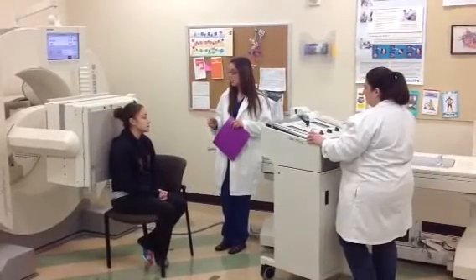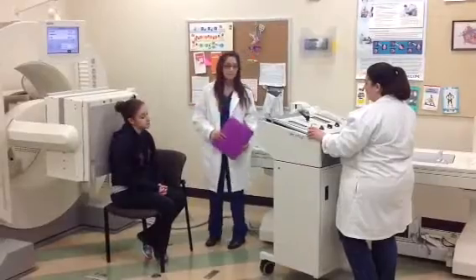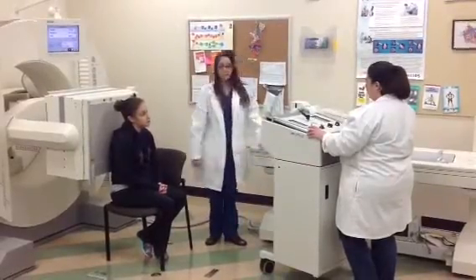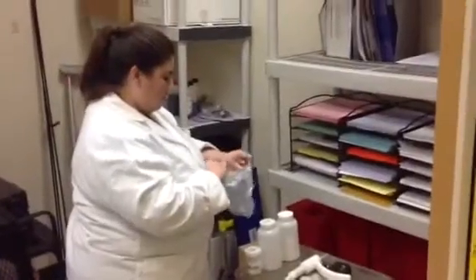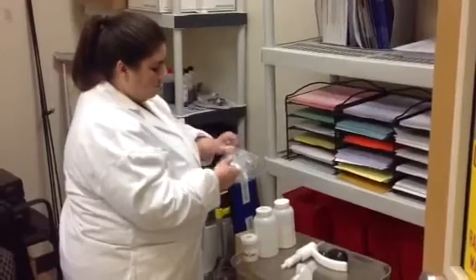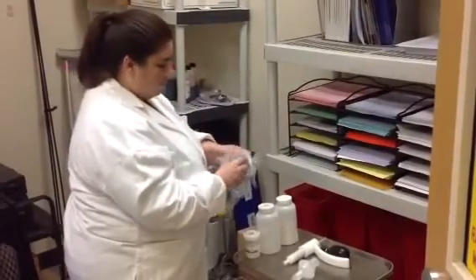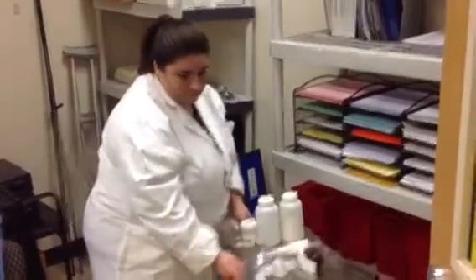Press the button on the front panel to add oxygen to the patient bag. Only add a small amount of oxygen, about 1/4 full. The bag will only move slightly. Do not fill it up. More oxygen can be added later if it is required for the patient. In many cases, it is possible not to add any oxygen and perform the entire study on ambient air. In all cases, the oxygen is only to enrich the air in the circuit.